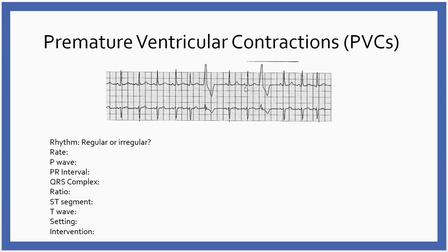The other thing we look at with PVCs is, remember the back of the T wave. Now, this is nowhere near the T wave, and that's good, but if this PVC landed on the back part of my T wave here, that's called R on T, and remember, the back of the T wave is a sensitive time in the cardiac cycle. The heart can respond, but abnormally, and your patient could go into a lethal dysrhythmia. So, intervention: assess your patient and fix the cause, whatever's making the heart cranky, and the PVCs will go away.